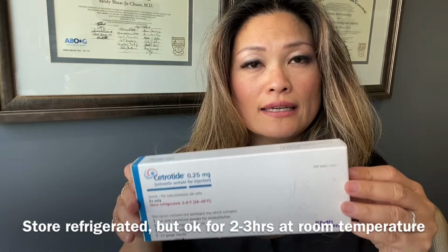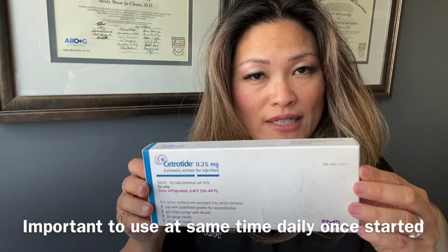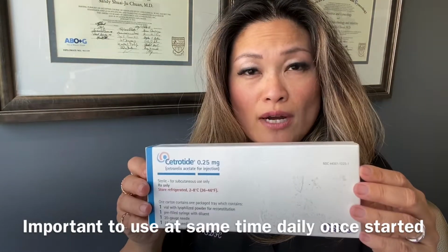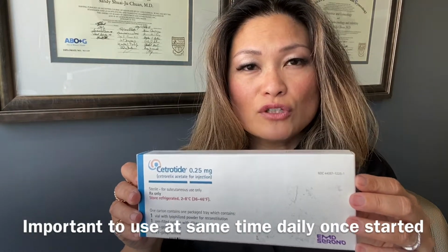And it can stay in room temperature for a few hours, but typically you want to keep it refrigerated. That's very important. And you want to make sure that you're doing this at the same time every day. So it's good for 24 hours, and you want to try to do it within 15 to 30 minutes of when you did it previously.